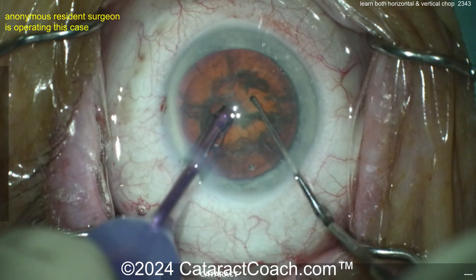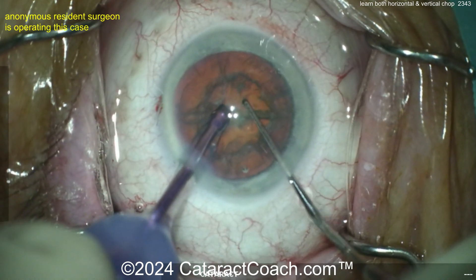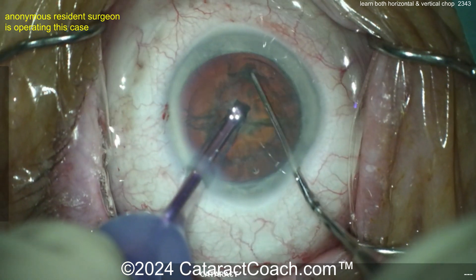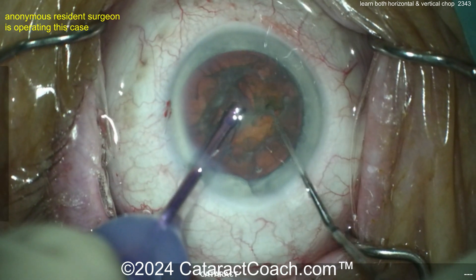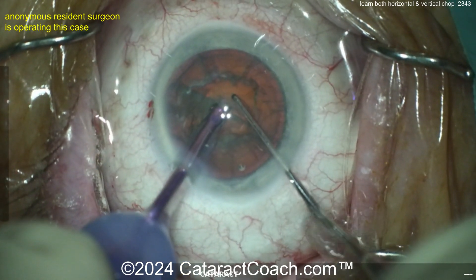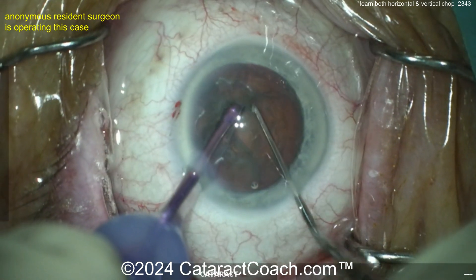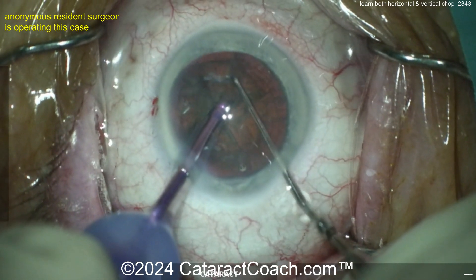Rotating it around again, get a good purchase. This is kind of like chopping wood — you start the chop here with the chopper and then you just propagate it all the way through, holding on and then pulling them apart. So a little bit of horizontal action there — that's why I also talk about combo chop. Combo chop means for me there's no big differentiator between vertical chop and horizontal chop; you can do both. Just chop it. Combo chop is a combination of both.